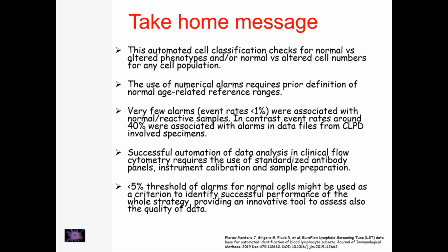And so you can evaluate all your procedure, the pre-analytical and the analytical phase. And this is again an added value to use this approach.